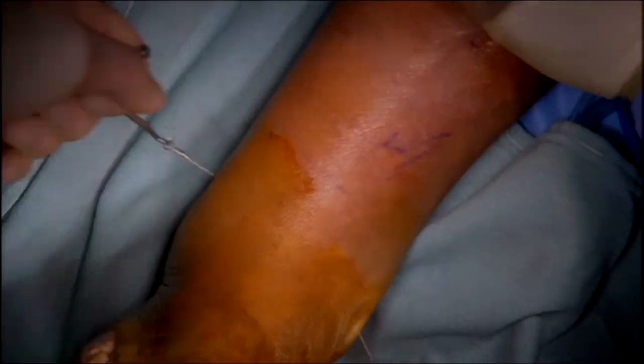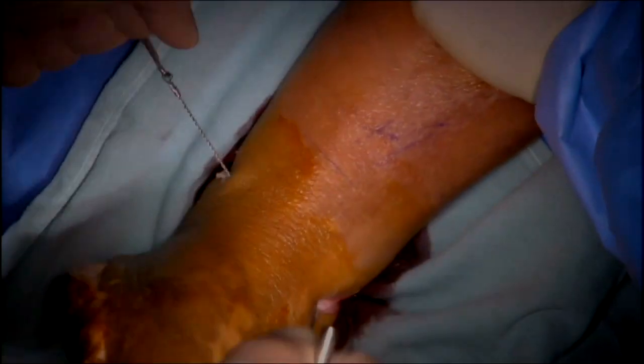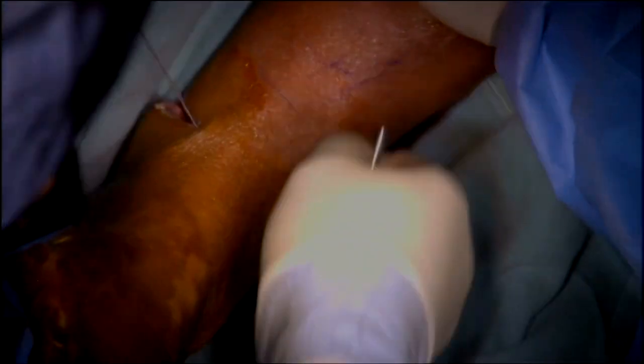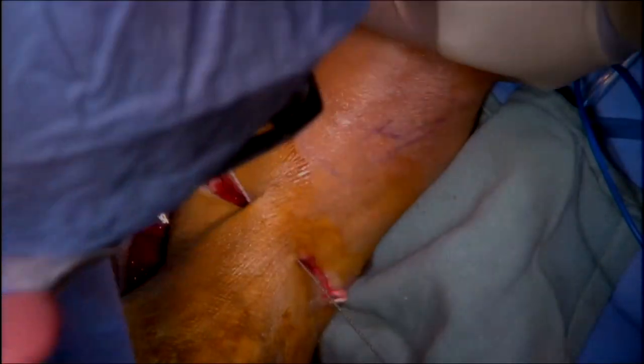A Gigli saw is positioned at the level of the ankle. The soft tissue and bone are then transected using the Gigli saw, starting on the posterior aspect of the lower extremity, and the transection is performed in a horizontal fashion towards the anterior aspect of the lower extremity.